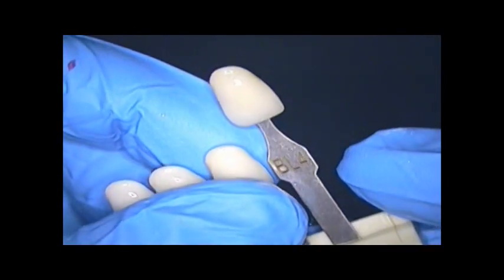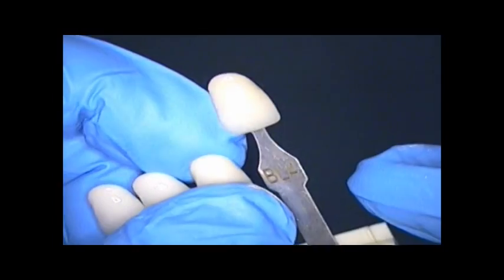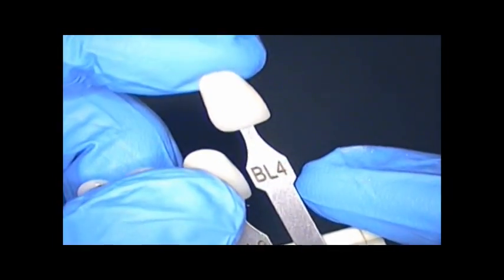In fact, the lab gave us back the crown with some stain on it. I did ask them not to stain it, but evidently they stained it, and so I just hand polished the crown, and it came out beautifully, and the color matched perfectly. So Emax does polish very well. Alright, so we're getting closer to our time. It's been about 4 minutes.